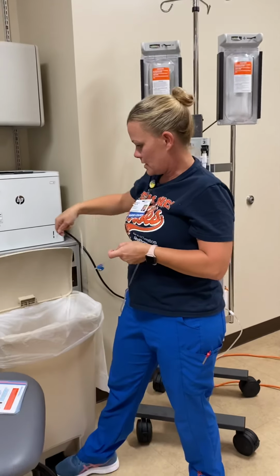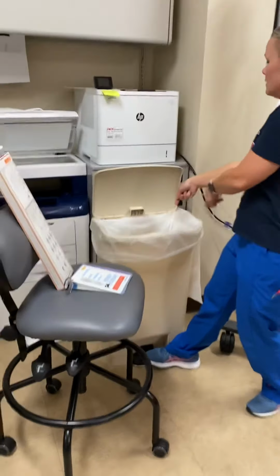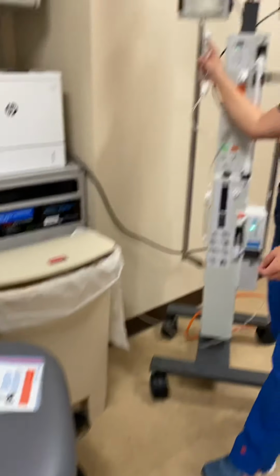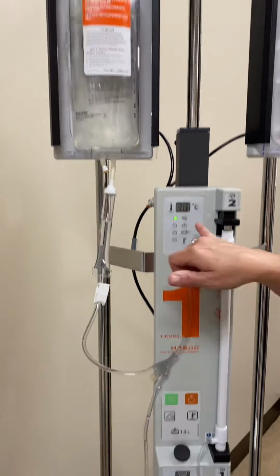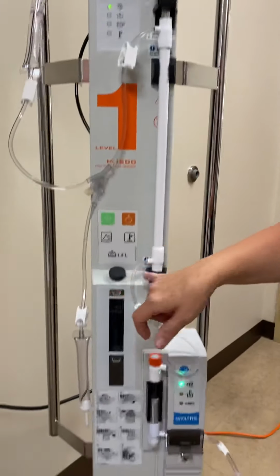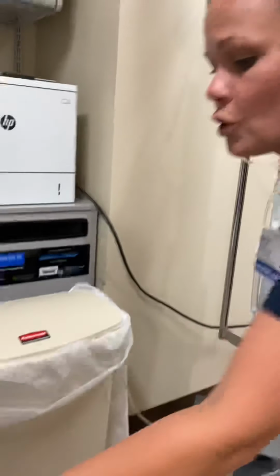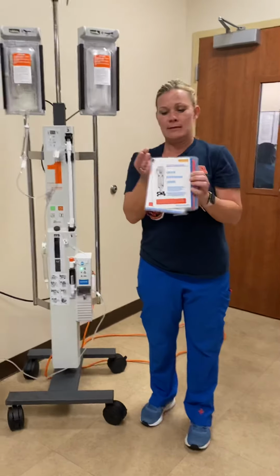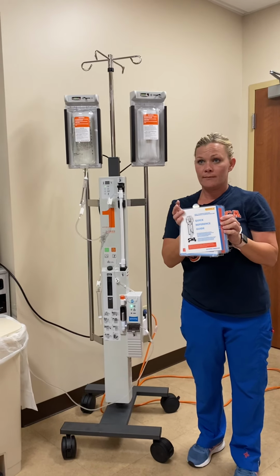Okay, so when I open it up, you see how fast it's flowing here? Then you can also tell here from this chamber. Anything that you see that has a light indicator next to it is a potential alarm that can happen. And those are all going to be in your quick reference guide. Like I said, this is kind of a down and dirty on how to get it set up. And that's it.